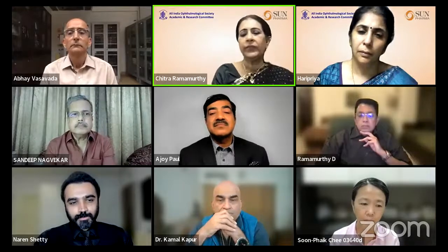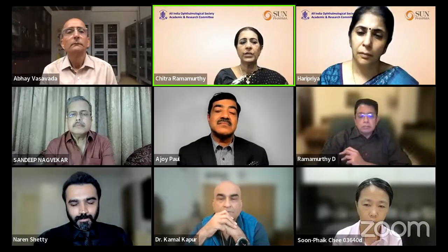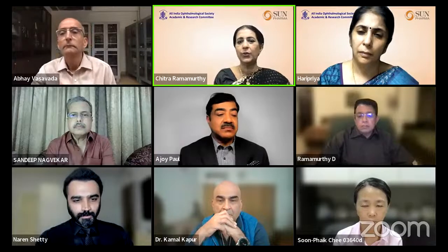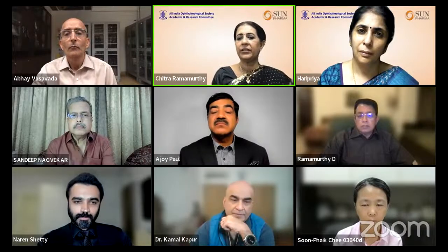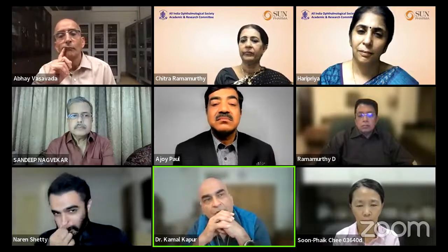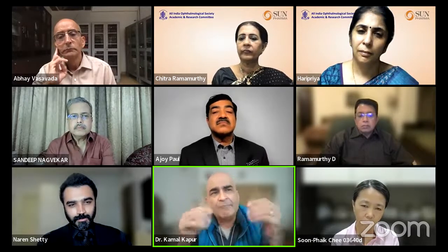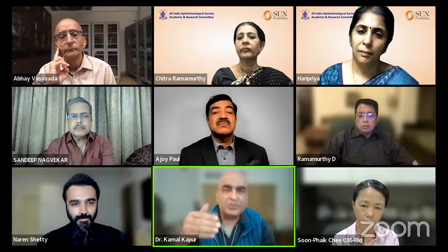Dr. Haripriya made a very good point that if it's an RP case or an eye with severe pseudo-exfoliation, making nicks on the anterior capsule during surgery would be one solution of sorts. How many of us do that actually? Yes, Kamal? I do that regularly. And in case I'm not going to do a nick in the rhexis, because most of these pupils may not be very large, I make sure I put in a CTR in these situations, because that further delays the situation for me.